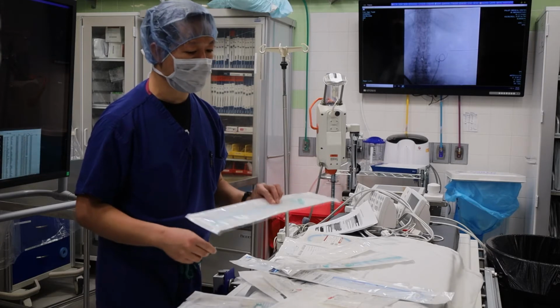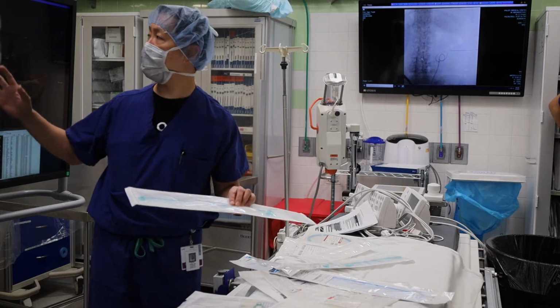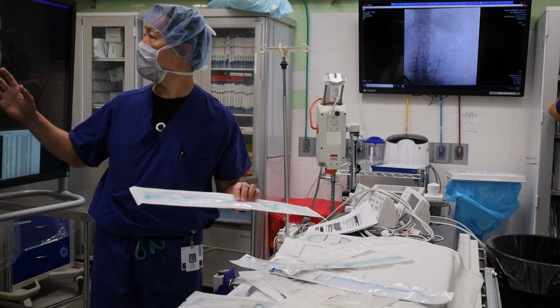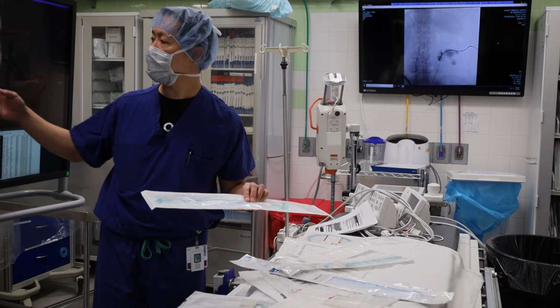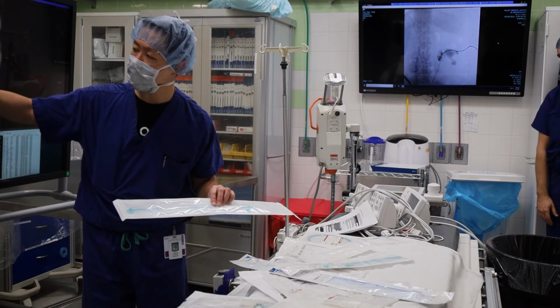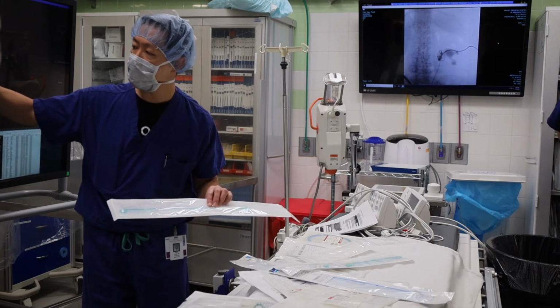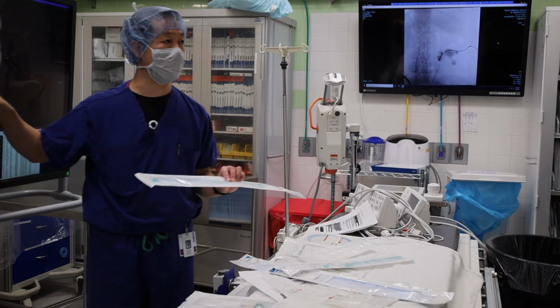Okay, so now this is in, everybody's happy, you take your picture, it looks good. Can you go to the last picture on this? Thanks. It looks pretty good. This is the calyx, this is part of the renal pelvis, and here's the stump. So we try to put this as far in as possible so that there's room to move back and forth when they breathe.